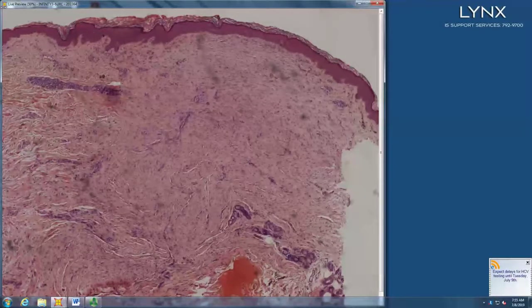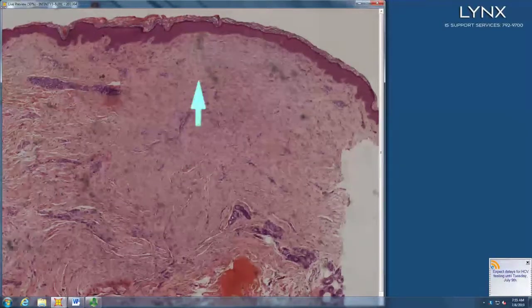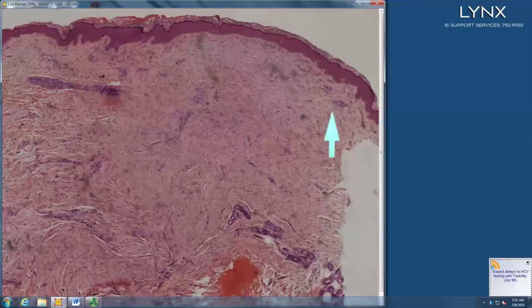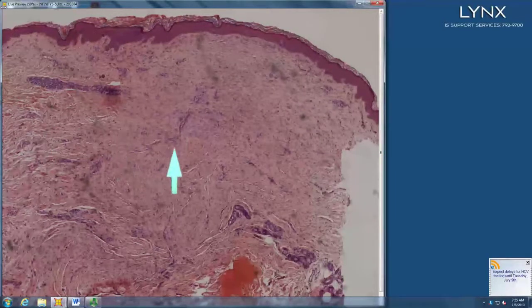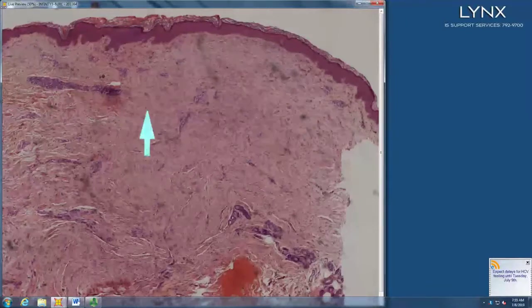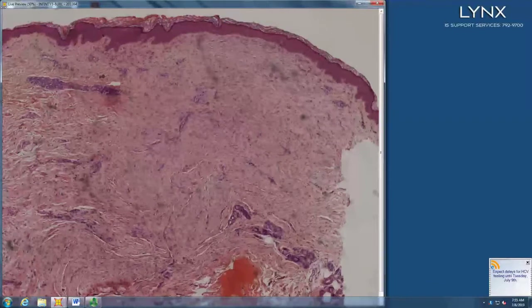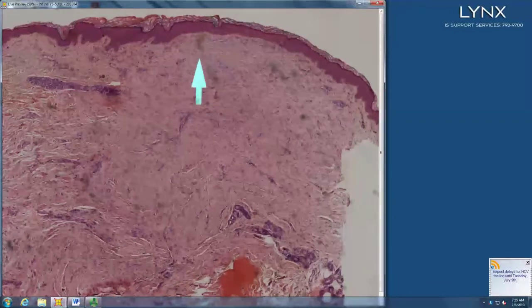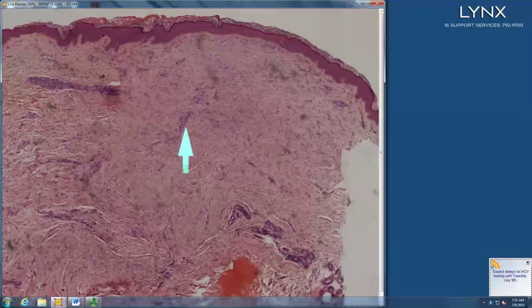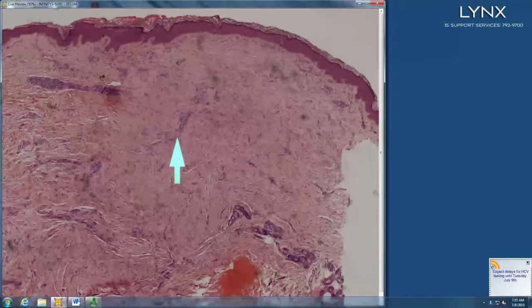Myofibroblastic proliferation with vessels that run north to south and fibroblasts that run east to west. So dermatomyofibroma certainly has east to west running fibroblasts, but in this case, it also has the vessels that run north to south, which is more like scar.